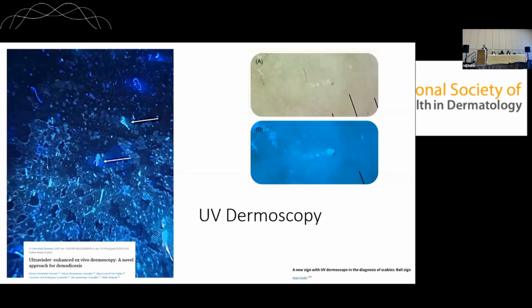And the UV dermatoscope was actually introduced to see if we can see regression. If you want to mark a margin, regression would be enhanced by using UV light. So for melanoma regression, you could see it if you are not able to visualize it through your regular dermatoscope, but adding UV light actually enhances that. But the cute thing, you know what these are?